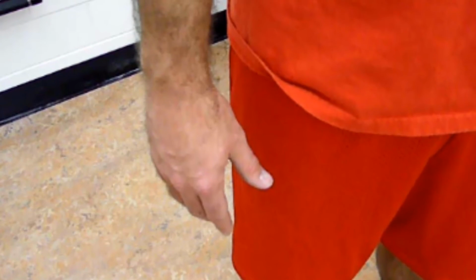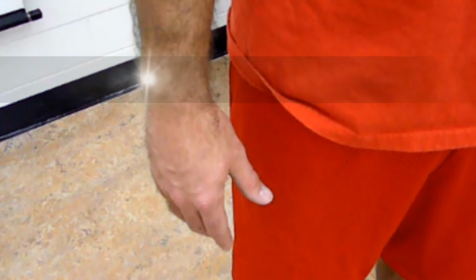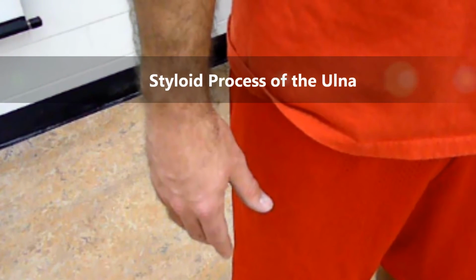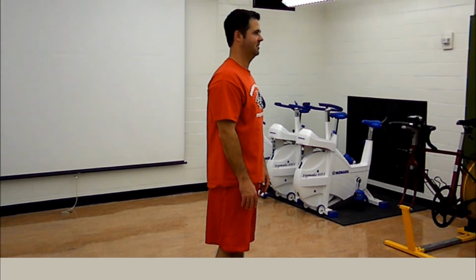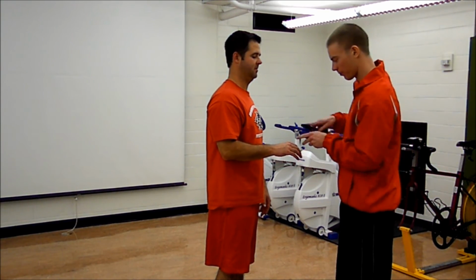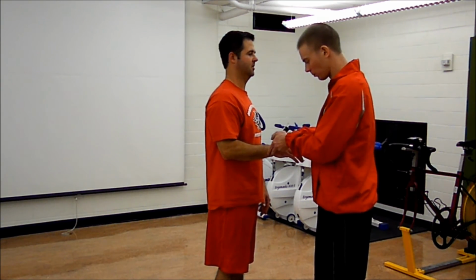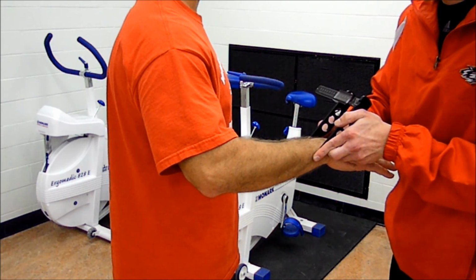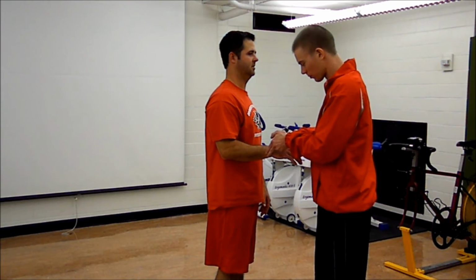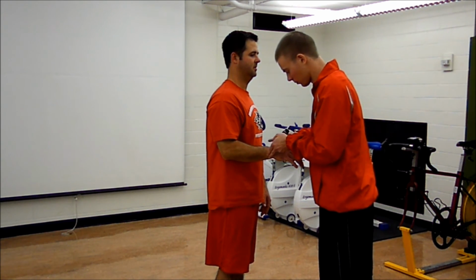The anatomical reference points for the wrist skeletal diameter measurement are the styloid process of the radius and the styloid process of the ulna. The participant should flex their elbow to a 90-degree angle with the upper arm vertical and forearm pronated horizontal to the ground. The caliper tips will be placed at an oblique angle on both styloid processes with firm pressure.